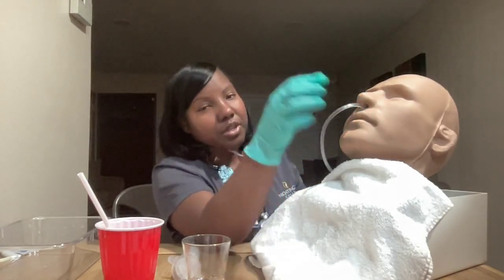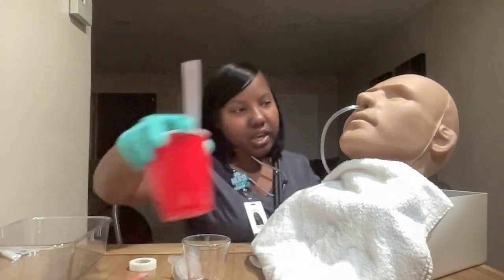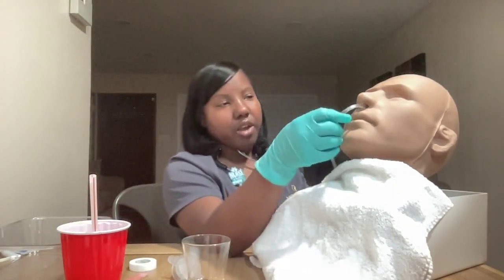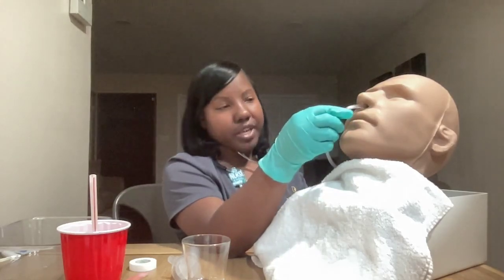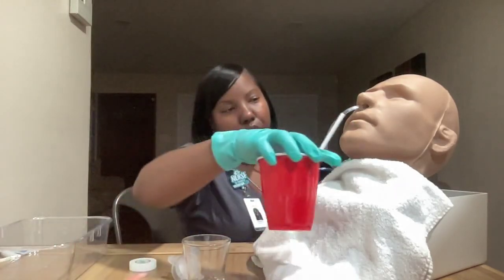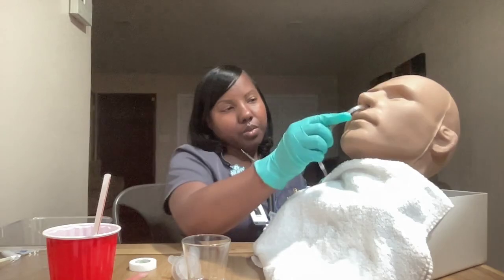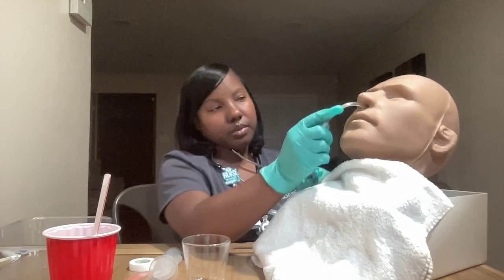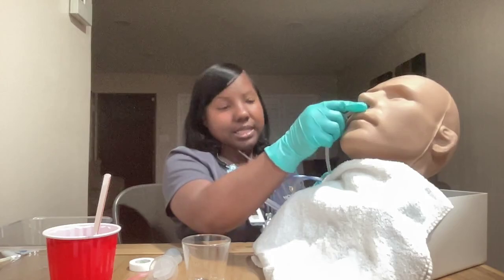Ms. Jones came up a little, which is my indication that the tube is at her throat. She gagged, so I gave her water and let her take a few sips. After the sips, I am inserting slowly, advancing about two to four inches at a time and allowing her to have sips of water. I am still advancing and have now reached my desired location.